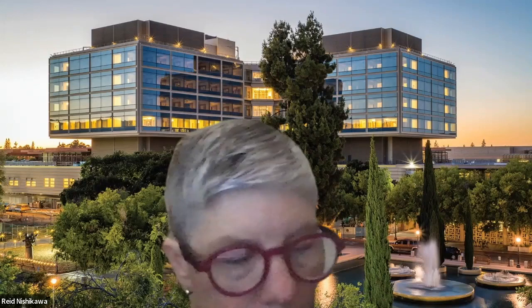Typically I'll order a CTV from the base of the skull through the pelvis, because I want to know where everything is. I don't want to just know what's in the chest. I want to know what all our options are. We'll be able to watch that dye go everywhere and see what's available. So that line that looked upside down, we'll know if that's available to us. We'll know how big the veins are, whether they're open, whether there's any clot, etc.